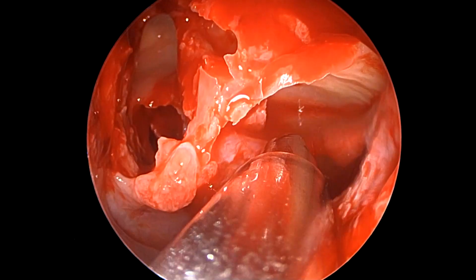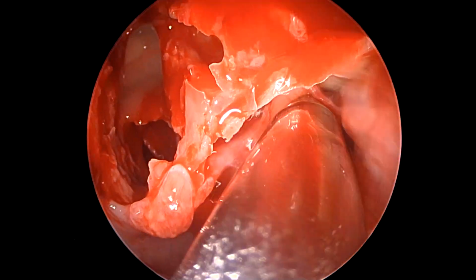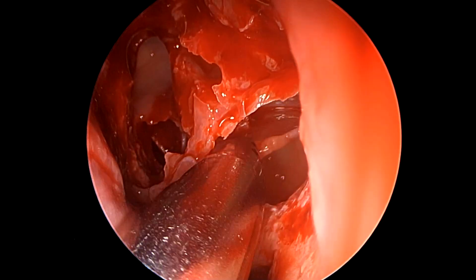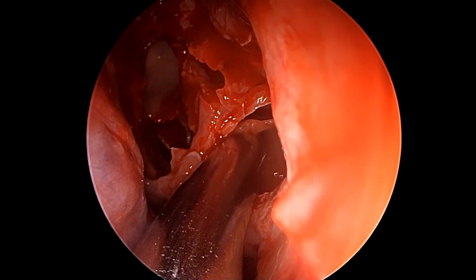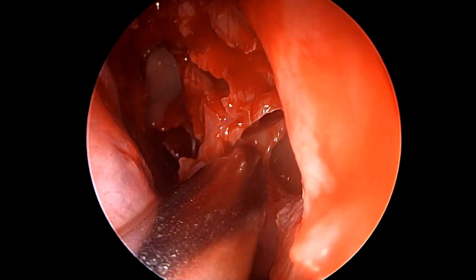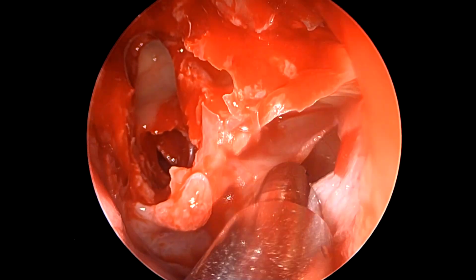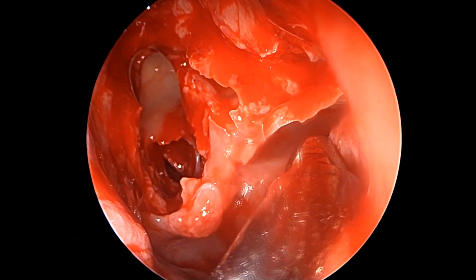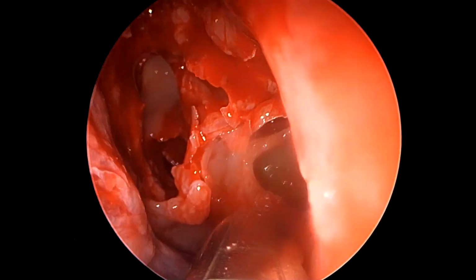Here we are just enlarging the maxillary sinus antrostomy to prevent any post-operative stenosis. Some posterior maxillary wall mucosa has been peeled off, which we can just incise, cut either using a true cutting forceps or the microdebrider blade, for it to fall back posteriorly. One must not avulse this mucosa and create bare bone, because that would lead to unnecessary granulations and scarring.